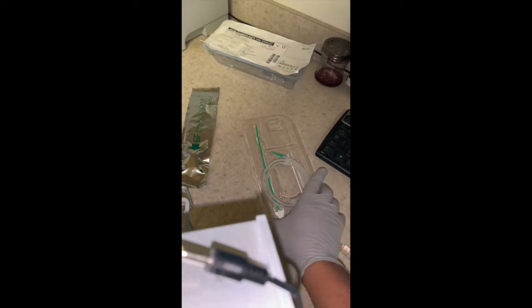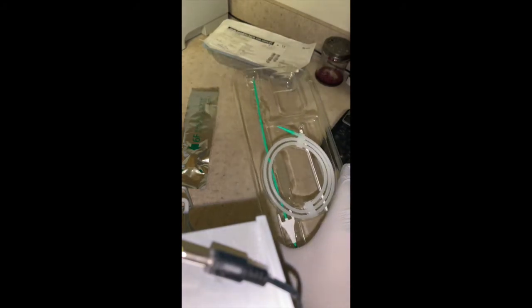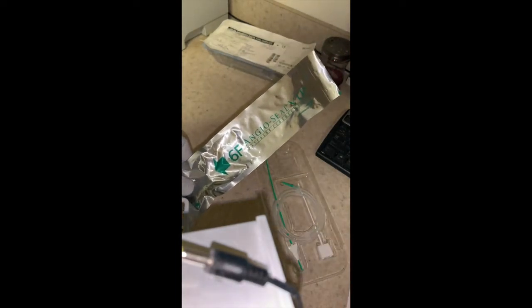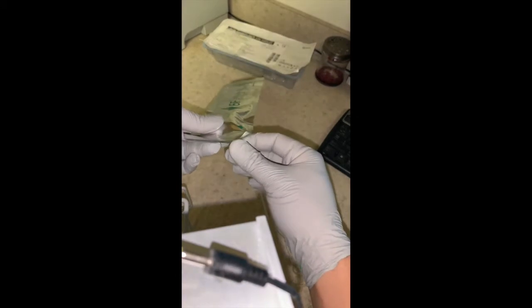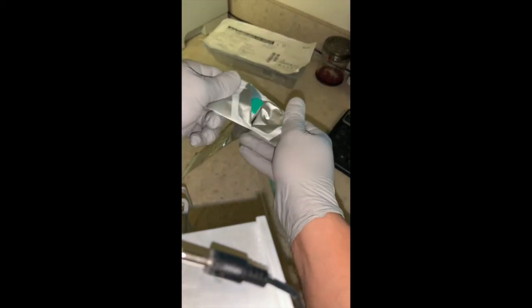We're now going to unbox and demonstrate the Angiaseal closure device. Here is part of the kit, and here is the other. You can open this up and gently remove what's inside.